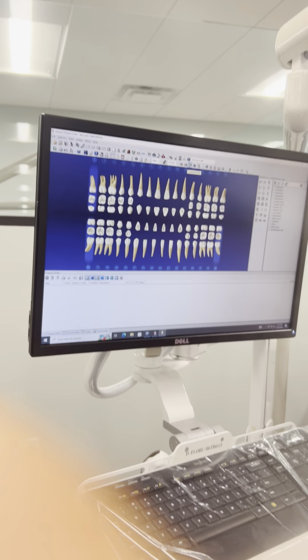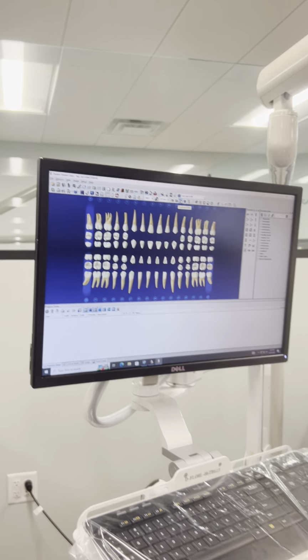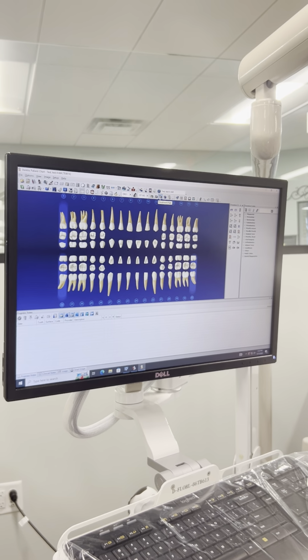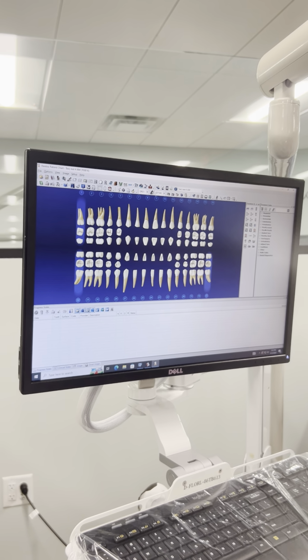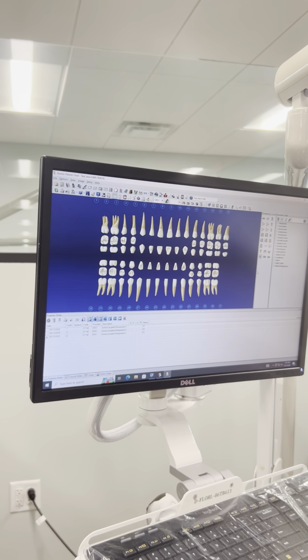And then treatment plan is when the dentist comes and does the exam, he may say, okay, we can put sealants on 19. You will select treatment and it will show red. So right now these are existing other, so we're gonna click on existing other and then boom, gone.